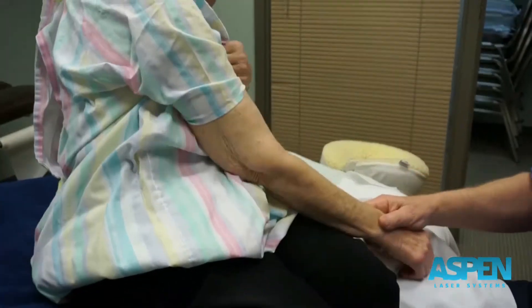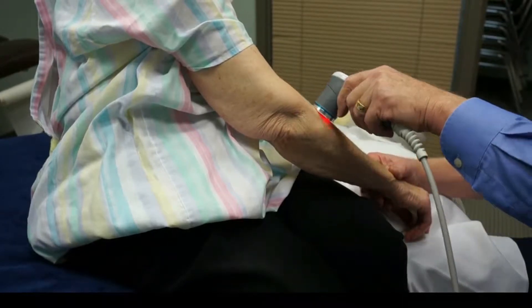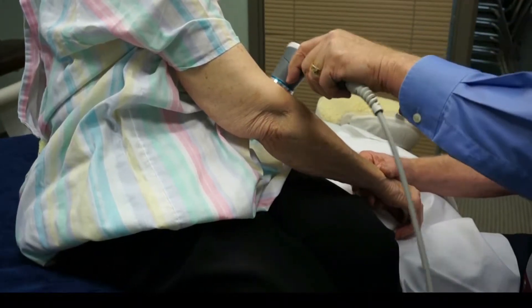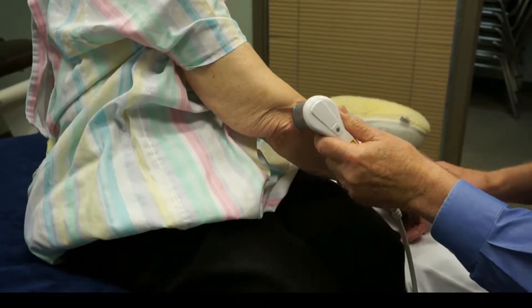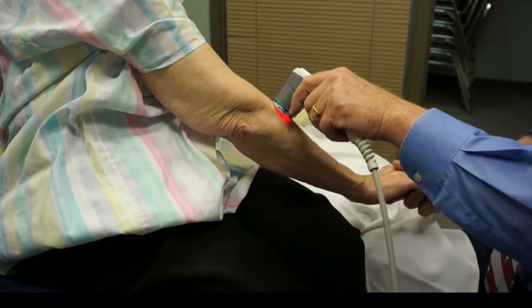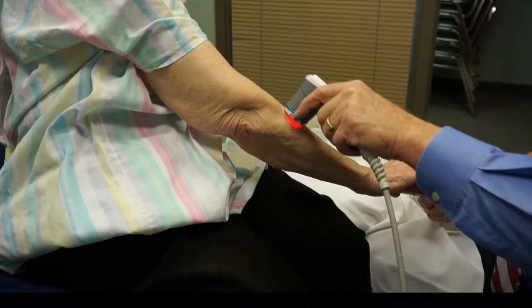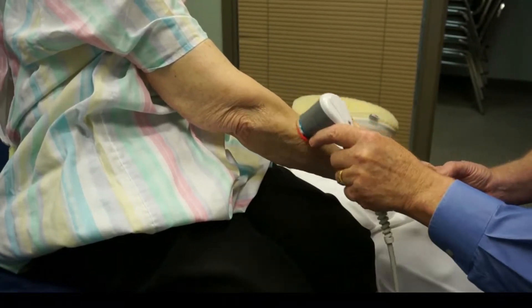Lateral epicondylitis — we're going to keep contact with the skin and work over the area. For manual resistance, a lot of what I use is hold the wrist up. Maybe test a certain finger, trying to isolate which portion of the tendon is being irritated.